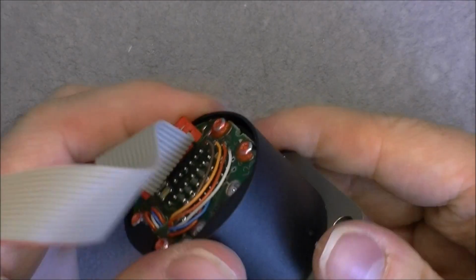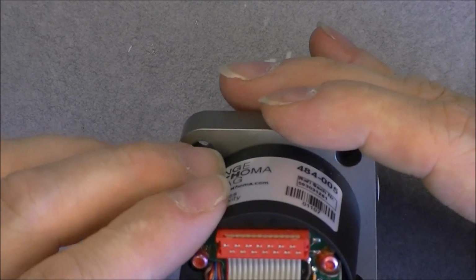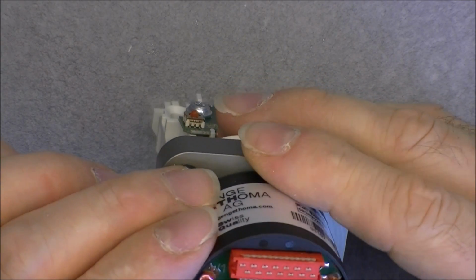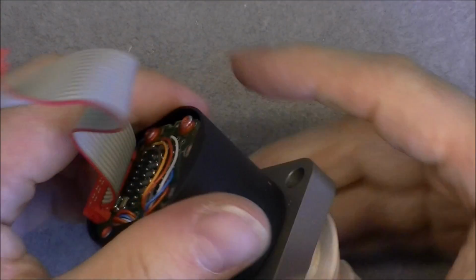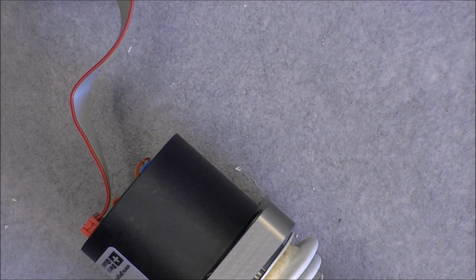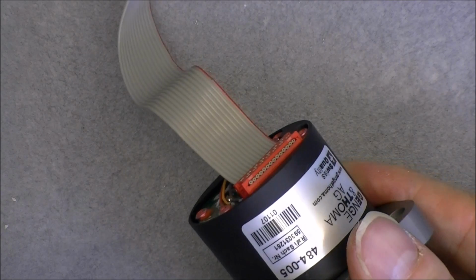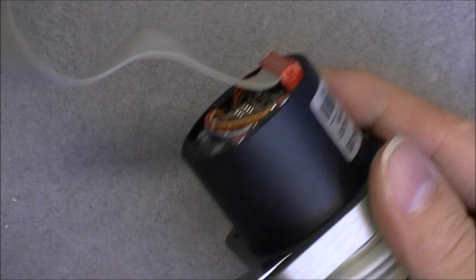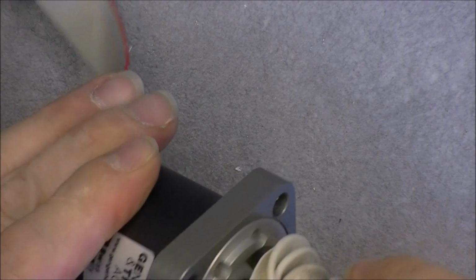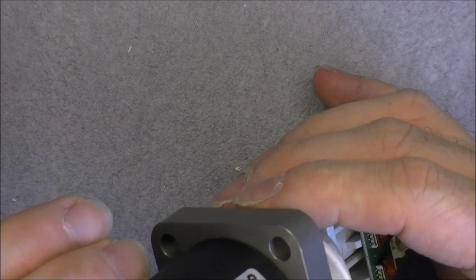I wonder if there is a way to remove this cover here. I do not see any screw, but it is moving a little bit. So I will try to gently pry it out. I have a feeling it is just clipped in place. In fact, in another controller it is clipped, but there are clips on the side. But here it is not the same thing. So we will probably check the insides on another one, I guess.